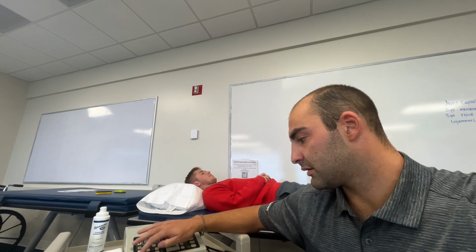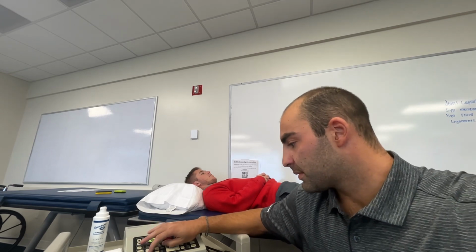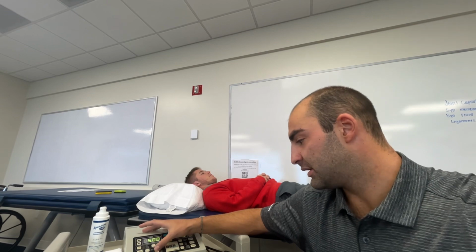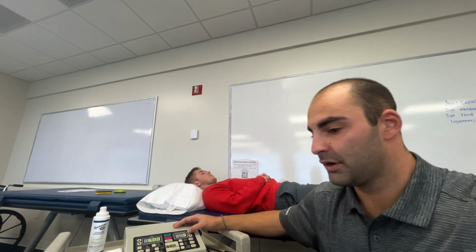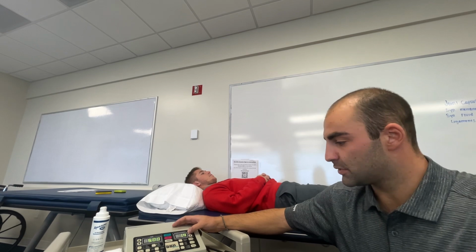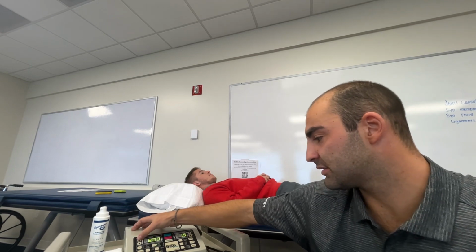All right. So, we'll be using 3 megahertz of frequency, a 20% duty cycle, and an intensity of 1.5 watts per centimeter squared. And then we can perform this modality for 5 to 10 minutes. I will set our timer for 8 minutes.